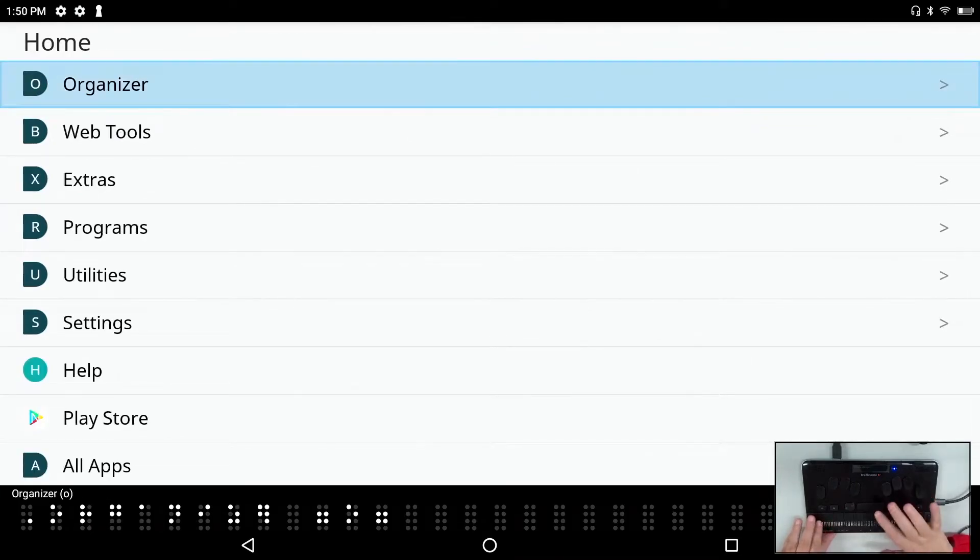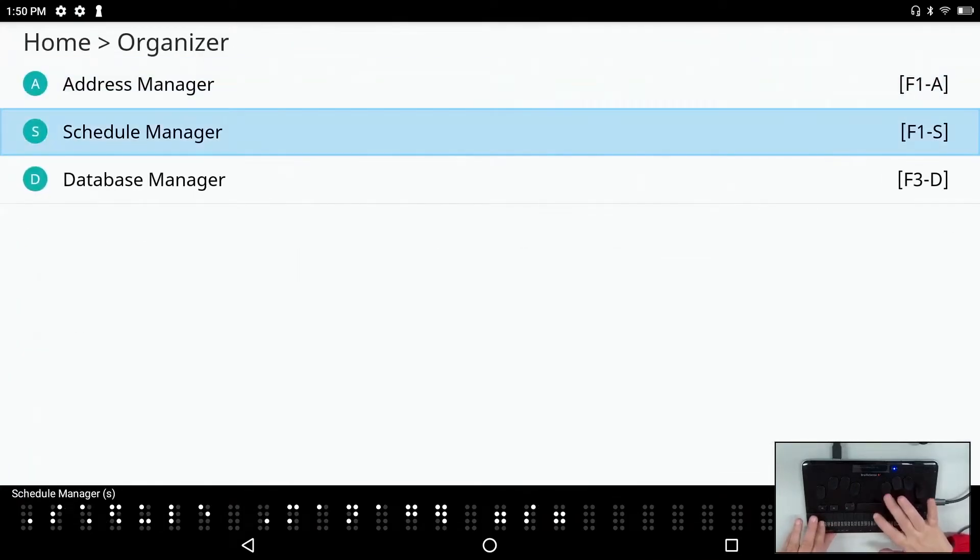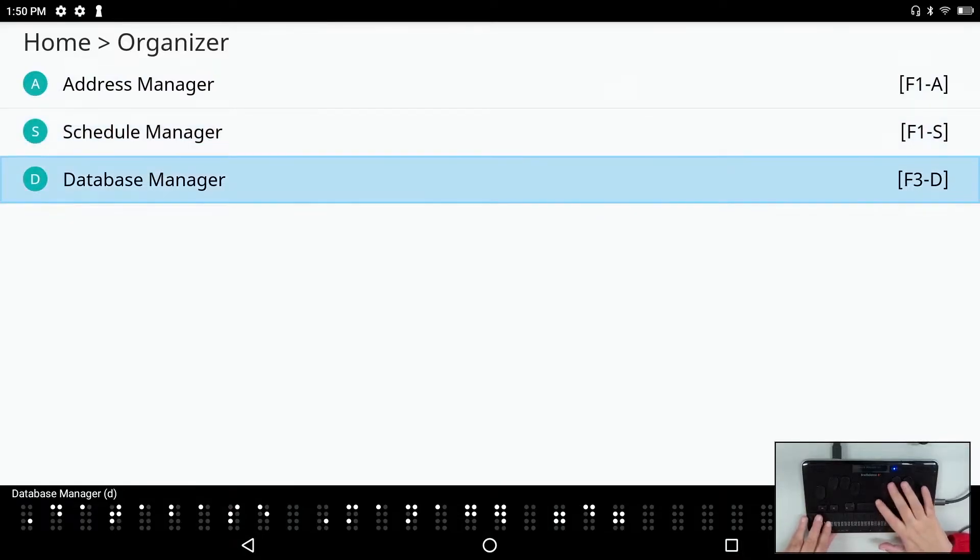We have our organizer menu with address manager, schedule manager, and database manager. We now have brought the database manager — which was popularly requested — to the BrailleSense 6.